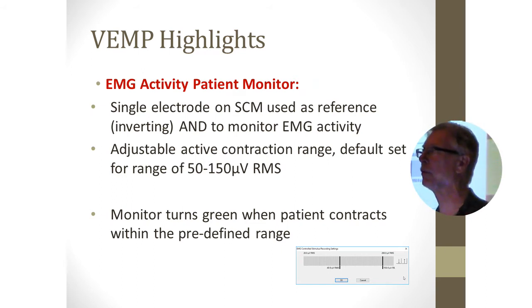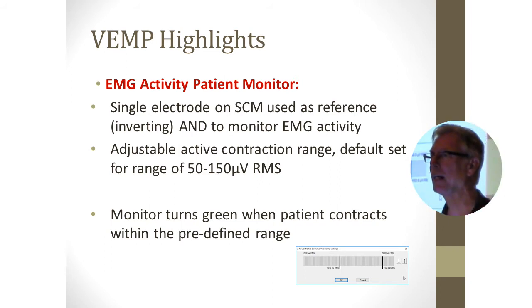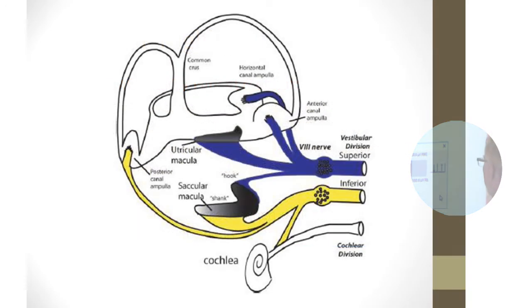I assumed it was equal before, but now that we have the monitor, I know that it's equal. In fact, there's an external monitor that you can put on these systems that actually turns green when the patient does it the correct amount and is red when they don't. So they can actually watch that while they're doing it, and they'll know that they're contracting the muscle properly. So that's an excellent thing in this system.